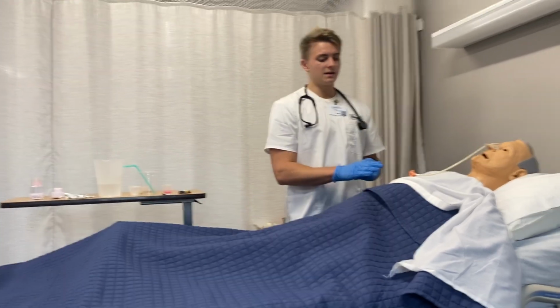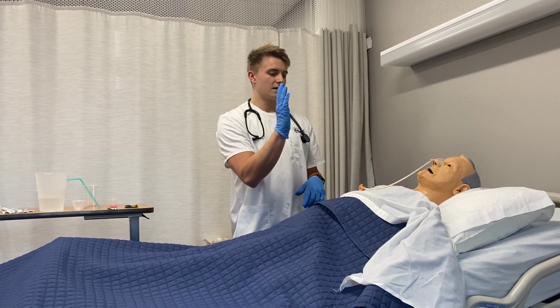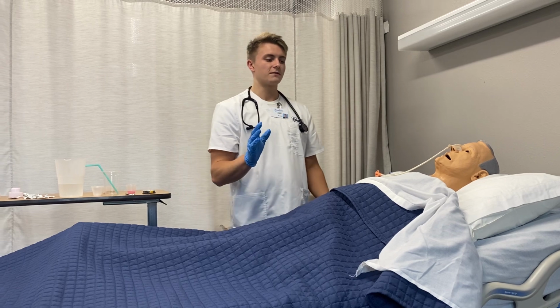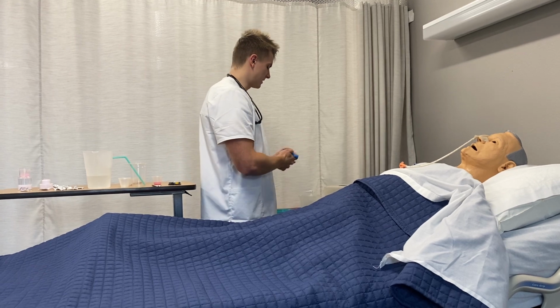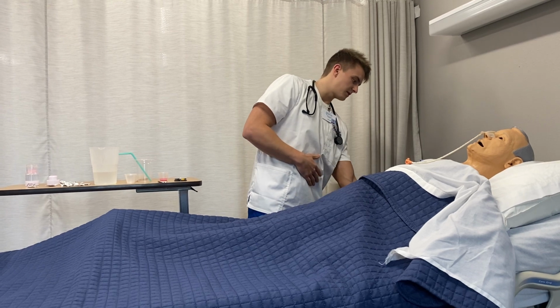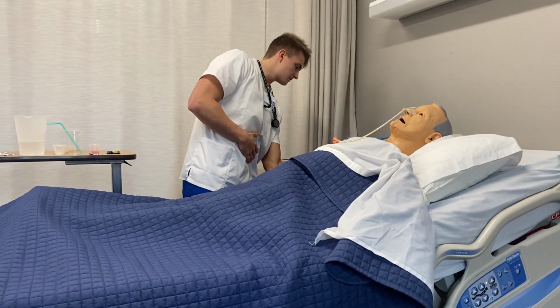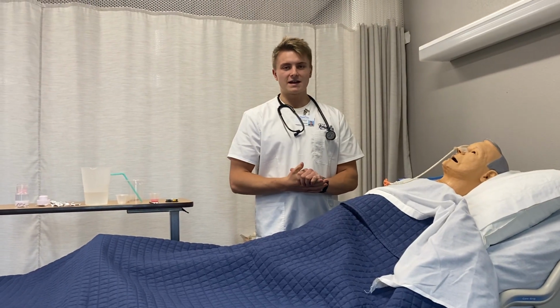Now that medication has been administered, now again the client would be resting a lot more forward, closer to 90, while this medication is being administered and while the tube is being inserted. Because of this demonstration, we cannot do that. And so now that we are done with everything, I'm going to doff gloves, and make sure that the client is in a good position, but still above 30 degrees. That he's still in 30 degrees, just to make sure that he's not aspirating.